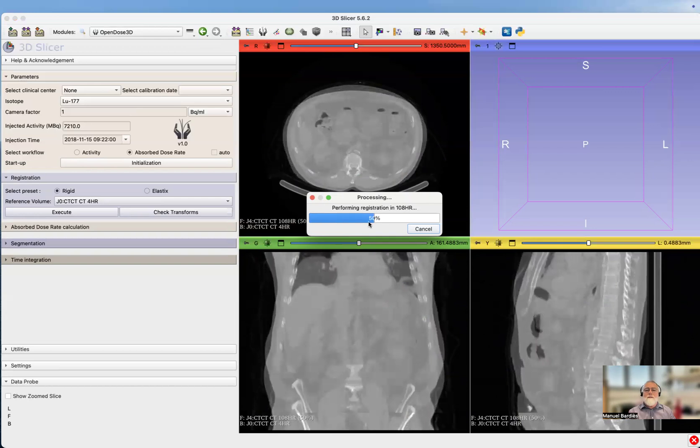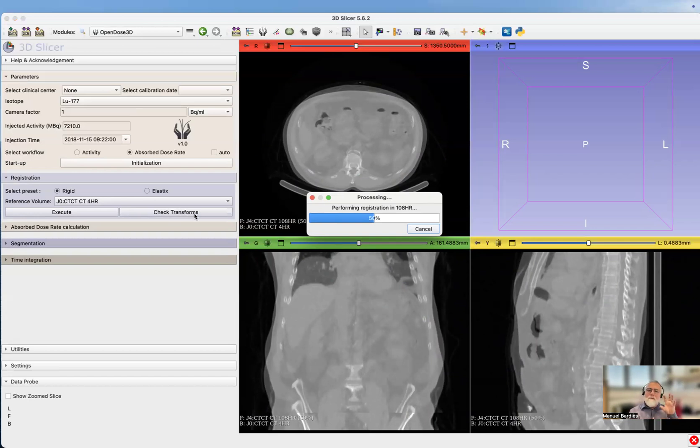You see, it's fairly quick because it's a rigid transformation. That is performed on the whole field of view, so you really have to be careful.